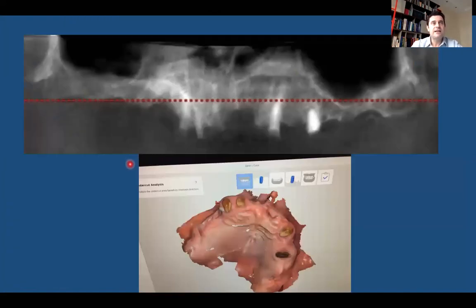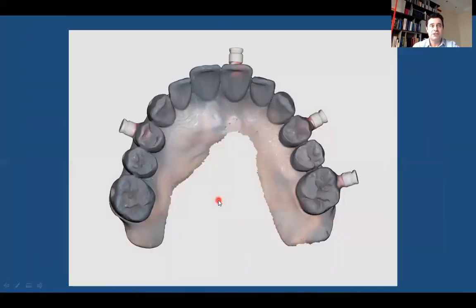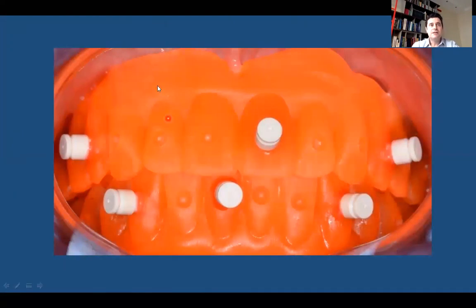In fact, this case shows the correct workflow that needs to be followed for right planning and an accurate and safe surgery. The analysis of the available bone and an intraoral scanning impression are preliminary operations, as well as some pictures from intra and extraoral examinations. Then a digital mock-up, in this case using exocad, was prepared and printed with a 3D printer. The occlusal check, as well as the aesthetic and phonetic checks, are necessary operations before passing to the next step.